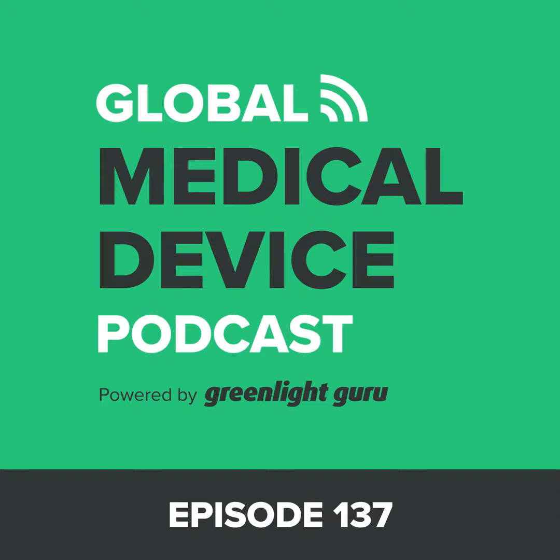A lot of it has to do with clinical trials and also how they do classifications. They changed a lot of the classification, especially IVDR. So there may have been some cases where you didn't have to follow a stringent process, but now you do. Yeah, and don't quote me 100%, maybe you can confirm this, but what I know about the changes with the EU MDR is that if your medical device has software or is software as a medical device, the biggest impact is its classification.